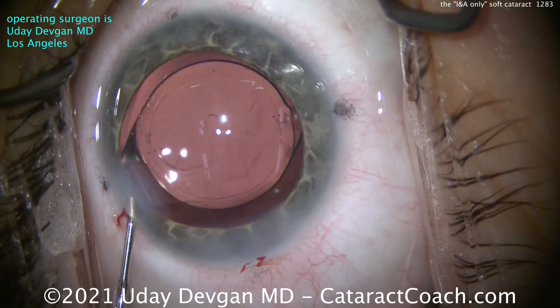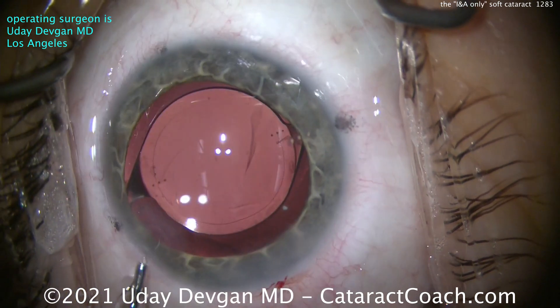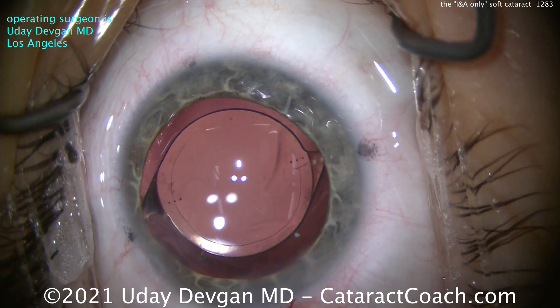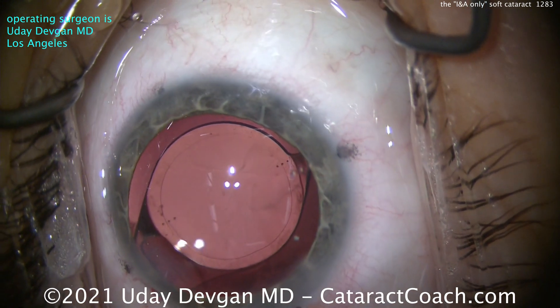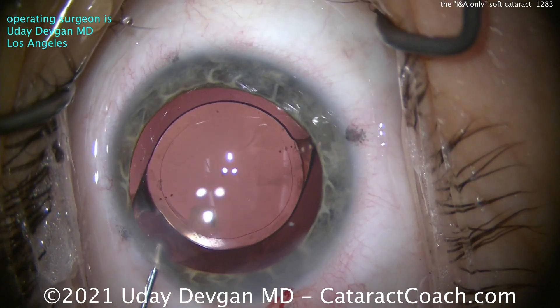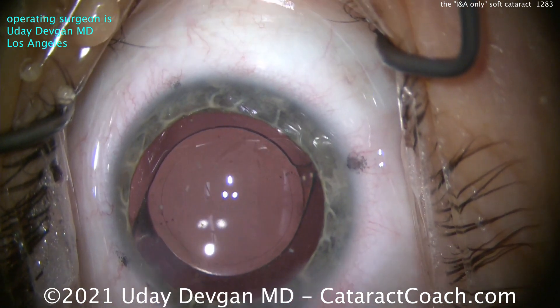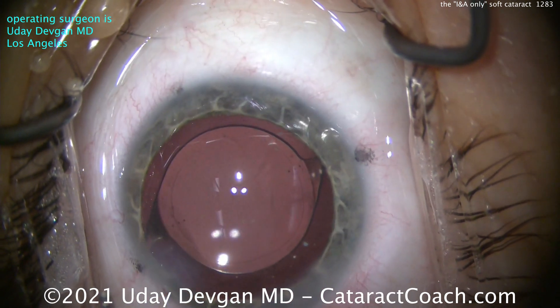I explained to the patient that for this cataract eye, don't expect great vision until that pupil comes down, and it may feel a little different than the LASIK did because this is more invasive — the LASIK is on the surface of the cornea, and this is in the eye, behind the iris. I'm glad we spent the extra time to get out that viscoelastic — that would have caused a pressure spike. We'll put a little more triamcinolone to get that inflammation under control, and also a little bit of preservative-free moxifloxacin. Swirl that around with the BSS, and then confirm the toric lens is beautifully lined up.